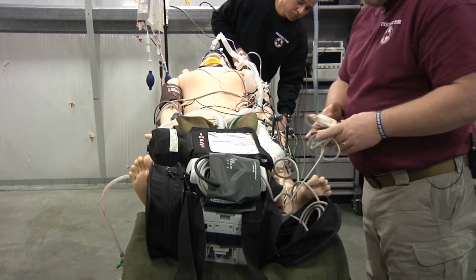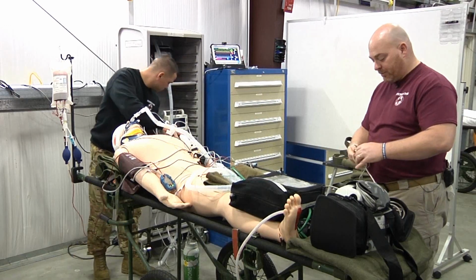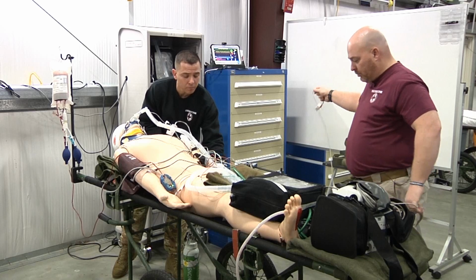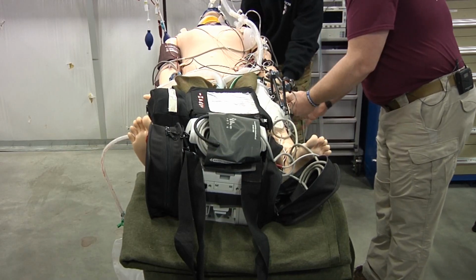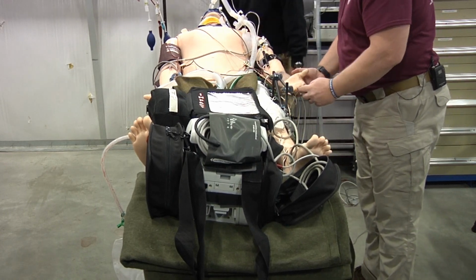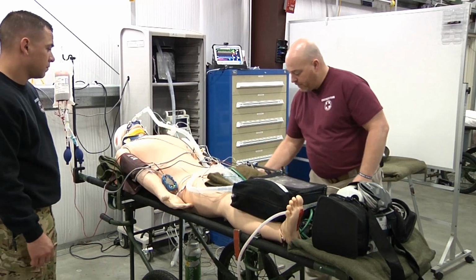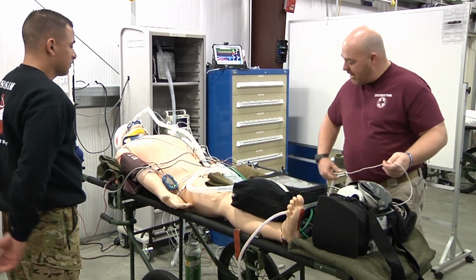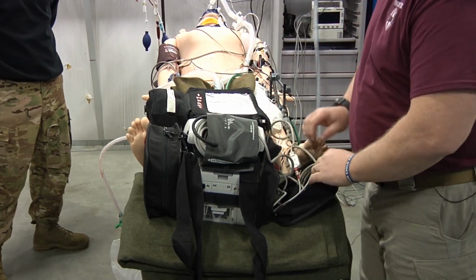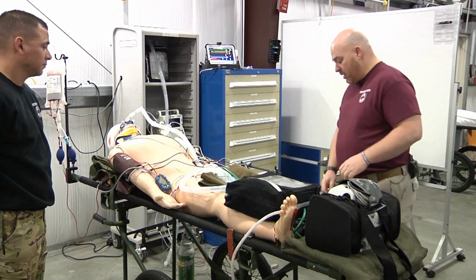Pulse ox. And again, removing all the hospital stuff, getting all of their lines and everything clear, and getting ours hooked in there good. All the excess line not being utilized is being placed back in the bag as to not get tangled. At this time, you could take some tape.